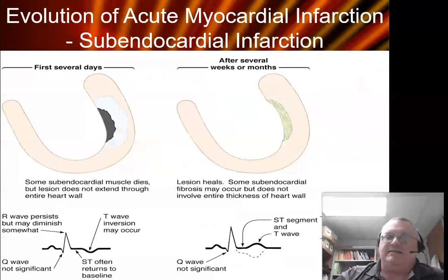Once that tissue dies, gang, actually I get T-wave inversion or ST returns to baseline, or worse yet, I can have permanent ST depression down here. So the person's ST can be like so. Now, again, do I know if it's an old infarct or a new infarct? Probably your best way to figure that part out is to say to your patient, hey, what kind of cardiac history do you have? It's amazing what they can probably already know. If they tell you that they've had a heart attack, you can expect there to be changes there, and maybe not be as panicked as you would be if I'm looking at it for the first time and go, oh.